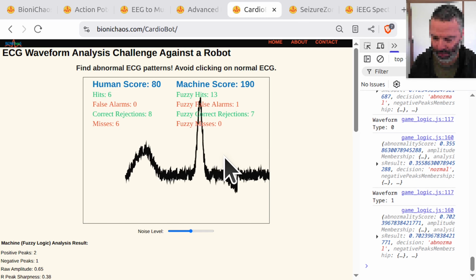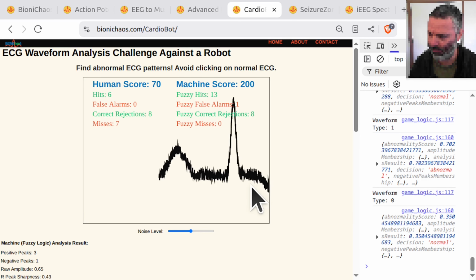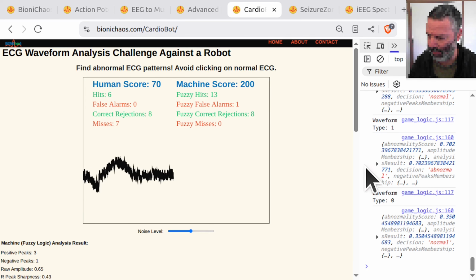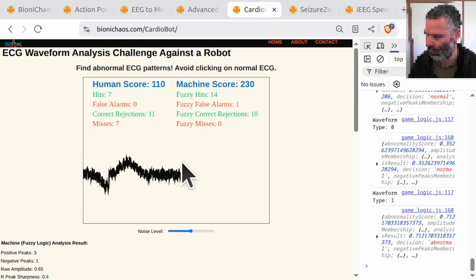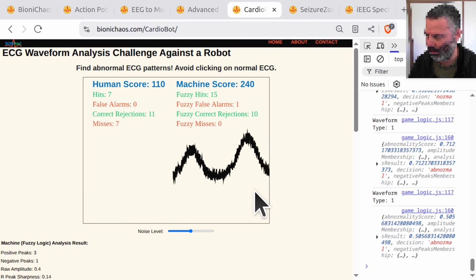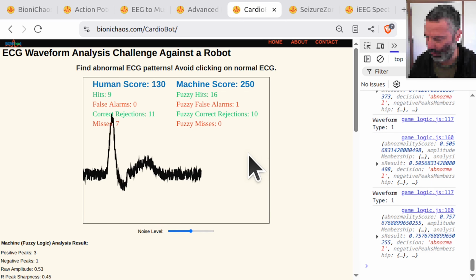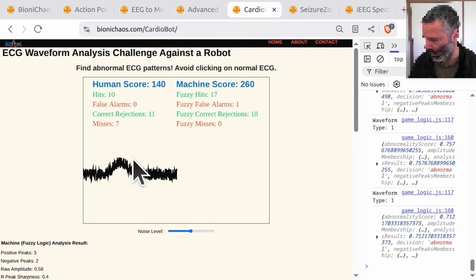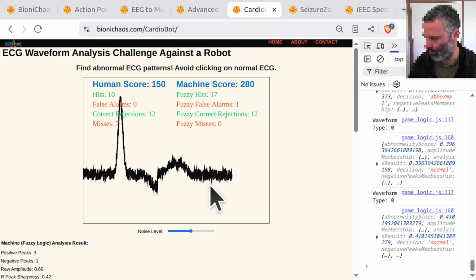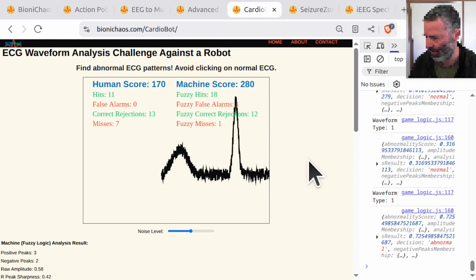We stuffed up something in the code. Yeah, that was correct. Correct, as in correct that we clicked on it, but this one, something weird.